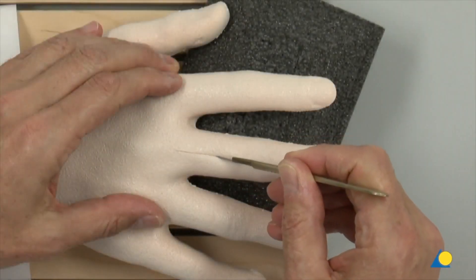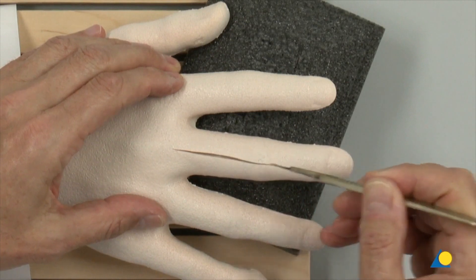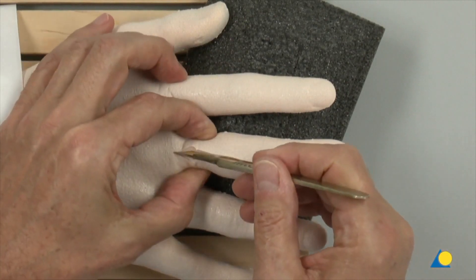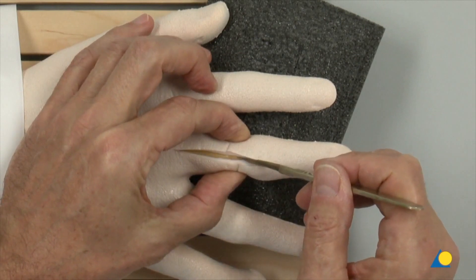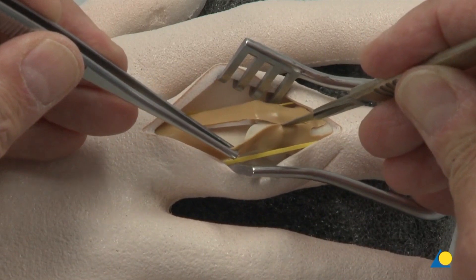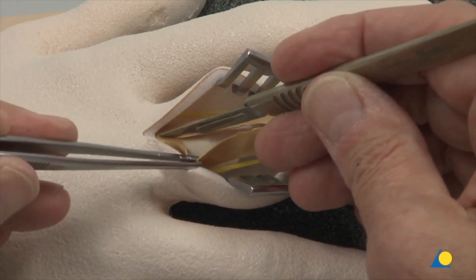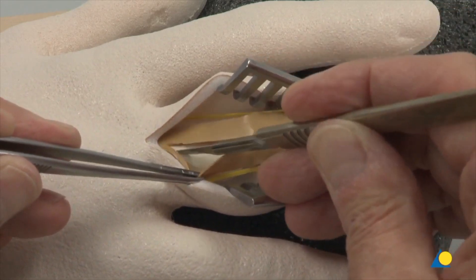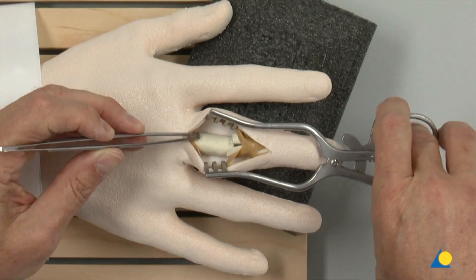A straight longitudinal midline incision is made over the proximal phalanx and the proximal interphalangeal joint. The central slip of the extensor tendon is incised and the fracture zone is exposed with the retractors.